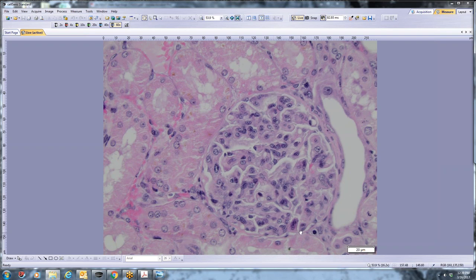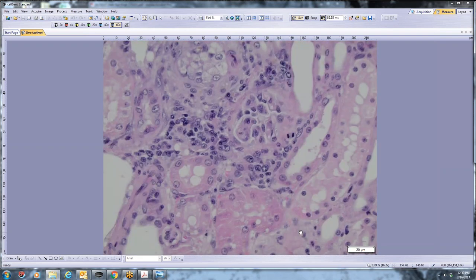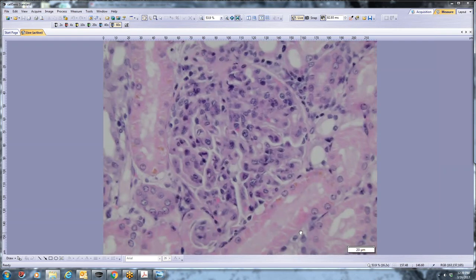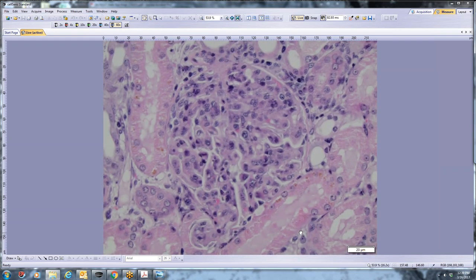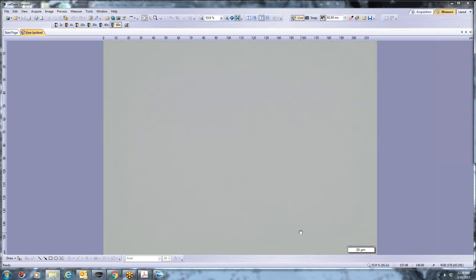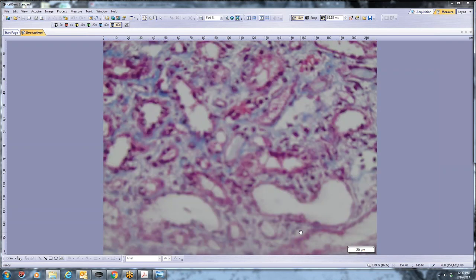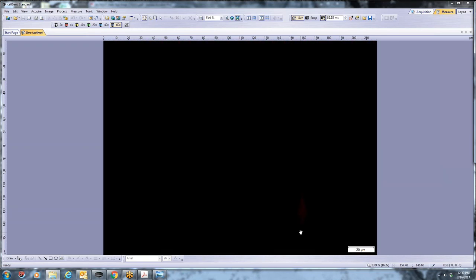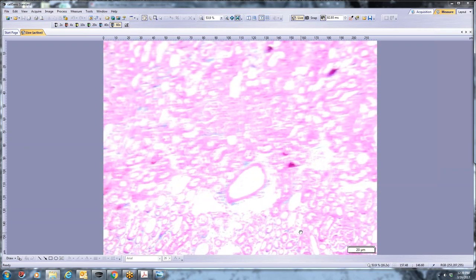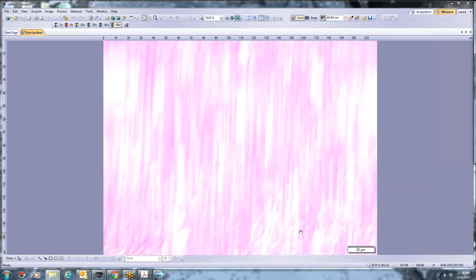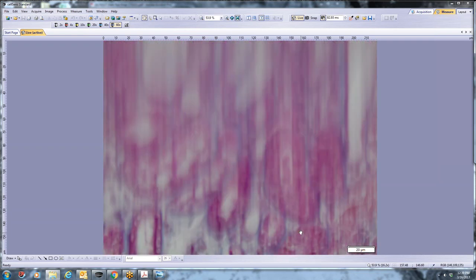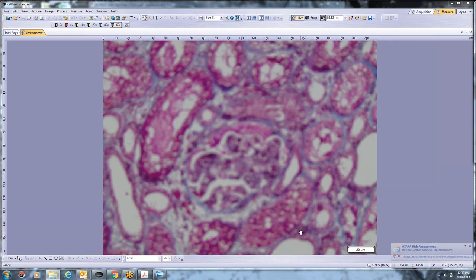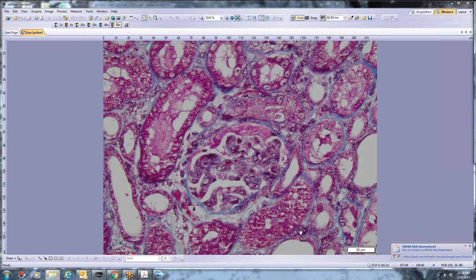These out here is probably a podocyte and he has multiple nuclei. Sometimes that happens. It's just kind of weird. So we'll move to a different stain that's a little bit easier to interpret.